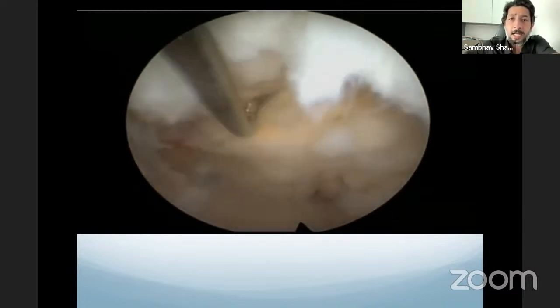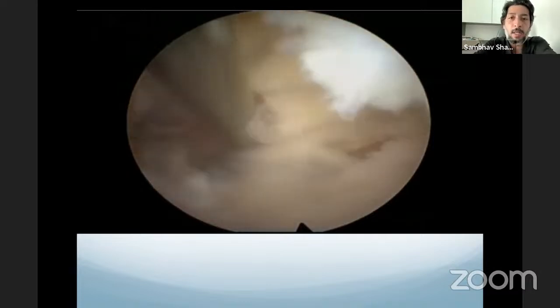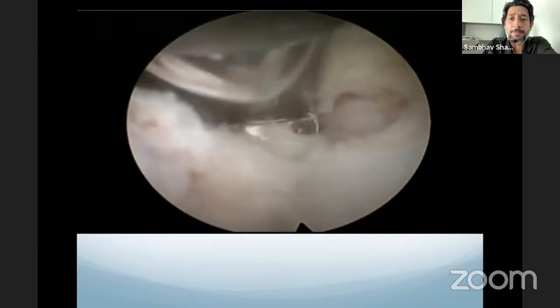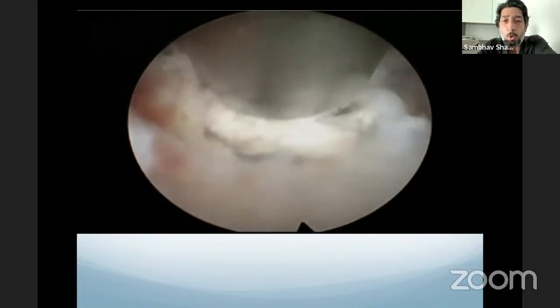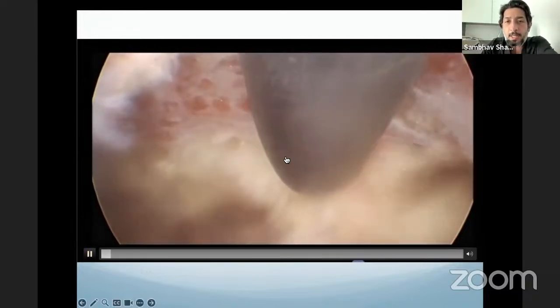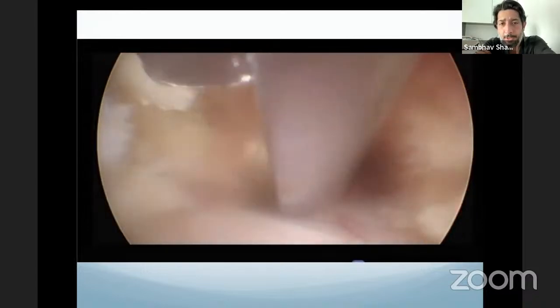Also be very wary that you may have flavum adhesions. So we have to be careful that there are no adhesions there, otherwise the chances of dural injuries are higher. Once you've done the ipsilateral side, there are 2-3 options. We can even go on the opposite side where you can do over-the-top decompression first and then come down towards the ipsilateral side, or vice versa. So for example, in this situation, we are burring the base of the spinous process. You can go to the opposite side and then you can do ipsilateral decompression.